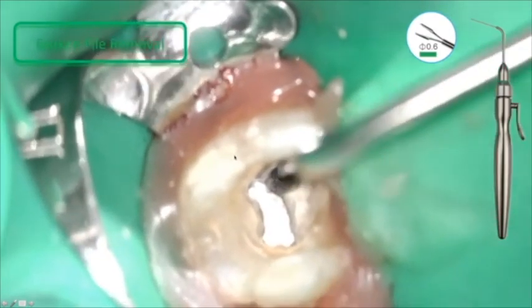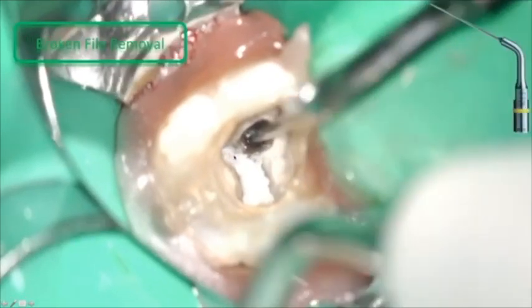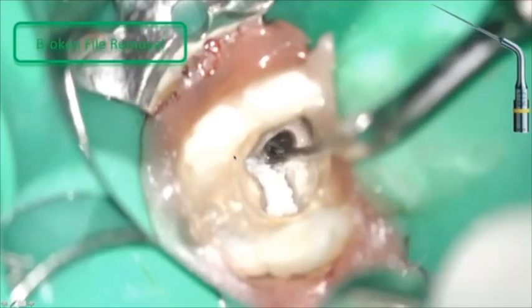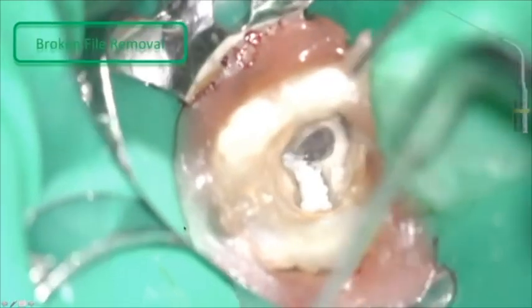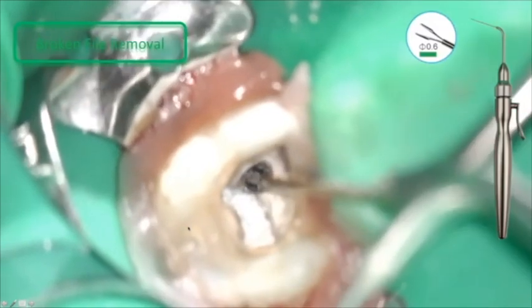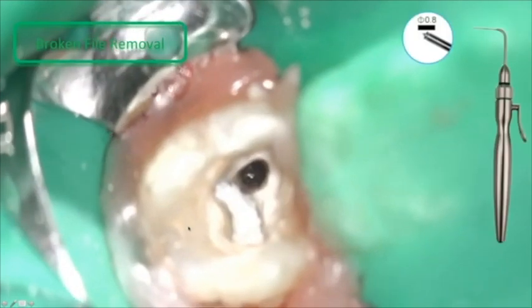The thing with the Zoomax extractor micro tweezer is that the instrument should be loose. If it's snug in the canal, you cannot remove it. It's very gentle at the end point. So the strategy is to be able to see the instrument, and the ultrasonics we use to liberate the grasping area, and at the end I try to grasp it again with the micro tweezer.